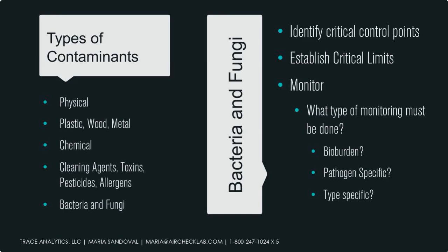But when you're using certain contaminants, the labs can actually see it. So I'm thinking of Lysols. We can see Lysols in your compressed air as limonene and pinene. I'm thinking toxins. If you're not controlling the temperatures of some of your products, your food products, they can off-gas toxins. Pesticides, if you have farm to table, or if you have any food growing type of protocols, you've got pesticides you need to be mindful of. Allergens, peanuts, any nuts, dairy, things like that. But lastly, what we're going to focus this talk on is the bacteria and fungi contaminants.